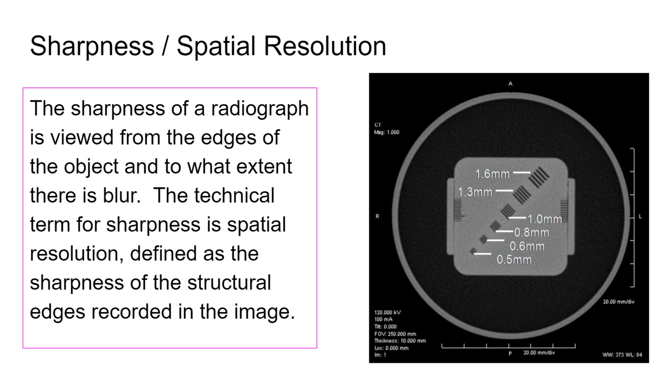If they start to clump together, then spatial resolution is getting worse. I'm not talking about being able to distinguish the shade of one grain from another. That's contrast. Spatial resolution is more of a quantity thing, being able to quantify an object.